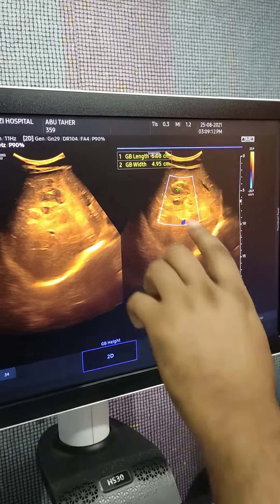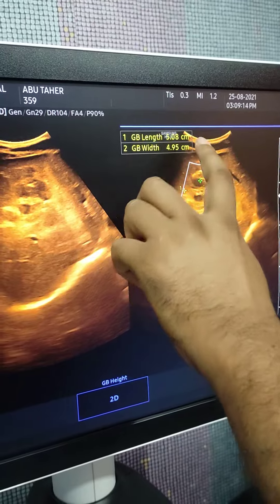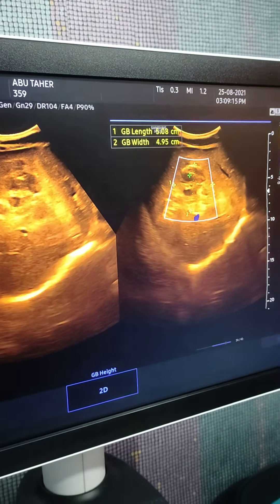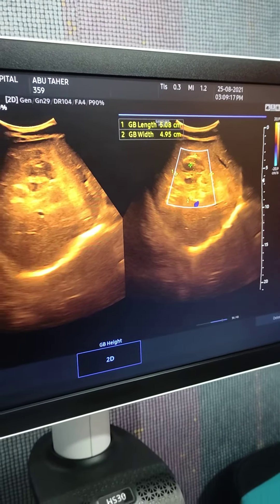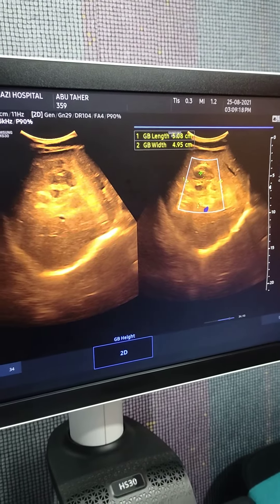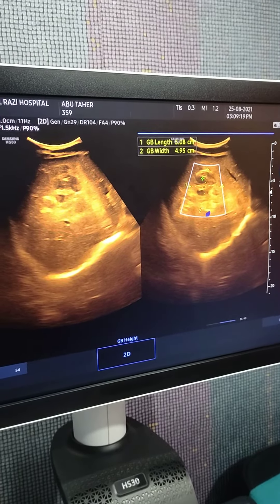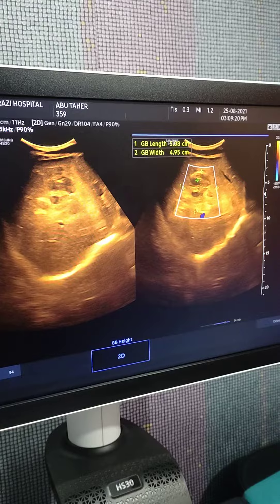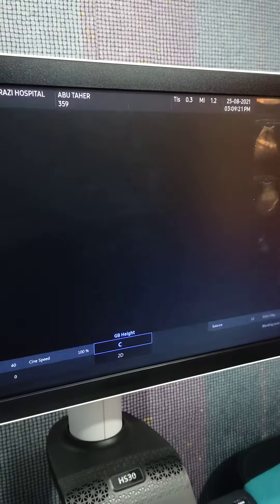Measuring 5.08 x 4.95 cm. This is a hydatid cyst in the right lobe of liver.